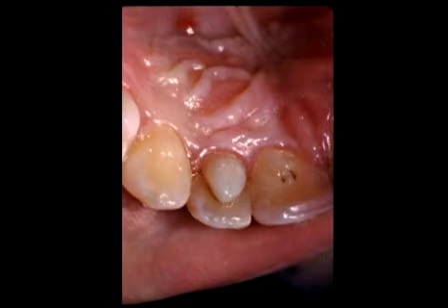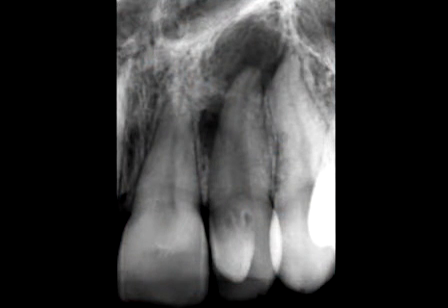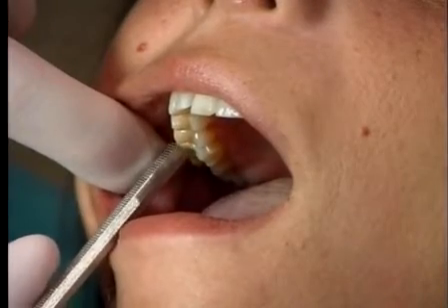Here you can see a dens invaginatus. Looking high in the vault, you can see a fistulous tract. When we take a film of this, you can see the dens. You can see it's a virgin tooth, but the deep invagination and groove allows for microleakage, and look at the massive breakdown endodontically. One of the favorite tests in the profession is percussion.